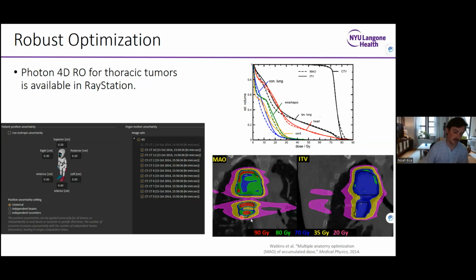And the nominal dose distributions again look sort of silly, but when you look at the expected value of the dose distributions under their error models, you'll find that more often than not, we're sparing structures that we want to spare and treating the structures we want to treat. So I think that this is clinically implemented in RayStation, but I have not had any practice with it.